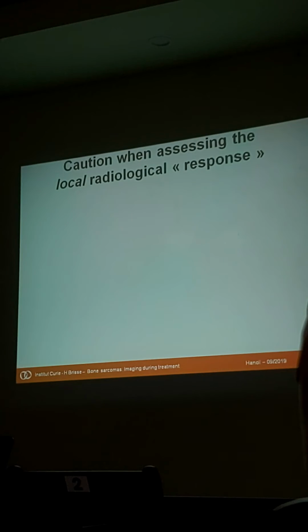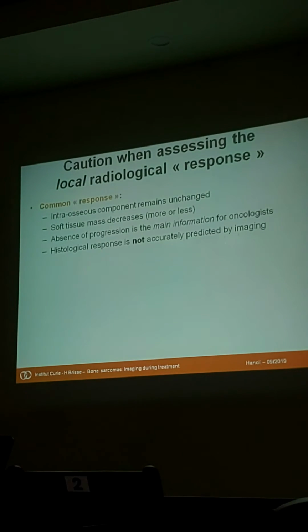So we must be cautious when assessing the local radiological response. The common situation is that the intraosseous component remains unchanged, the soft tissue mass decreases, and the histological response is not accurately predicted by imaging, but we can say to the pediatrician the main information is the absence of progression.